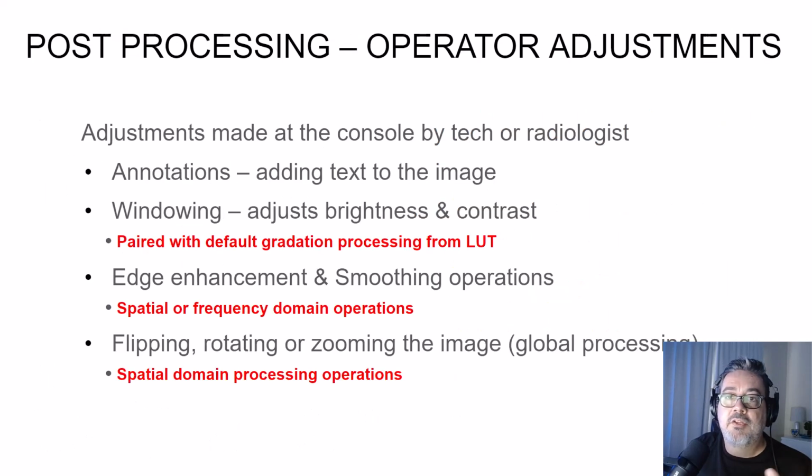Post-processing is what you're likely more familiar with. They're adjustments made at the console by the technologist or the radiologist, and they include annotations, adding text or arrows. I see a lot of techs out there annotating their markers, which is a horrible idea. I've seen so many issues pop up when a tech relies on annotating their markers and for whatever reason annotates the wrong laterality, but that's a topic for another discussion. Just use your lead markers.